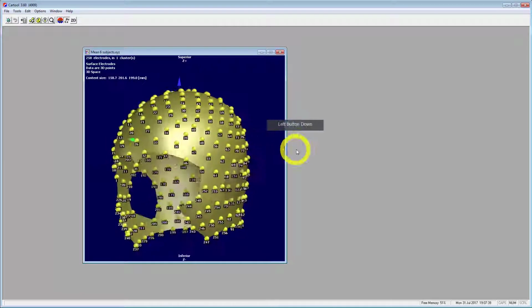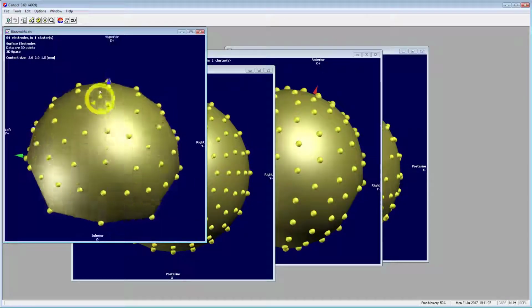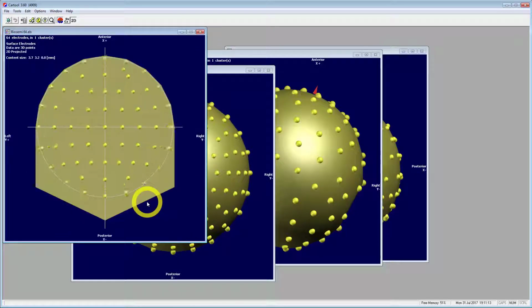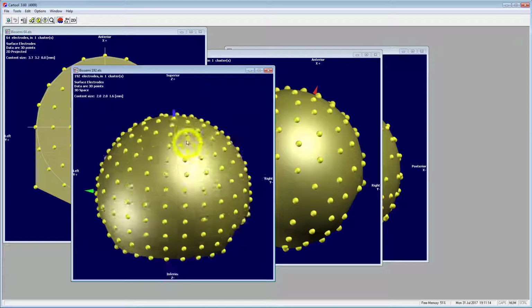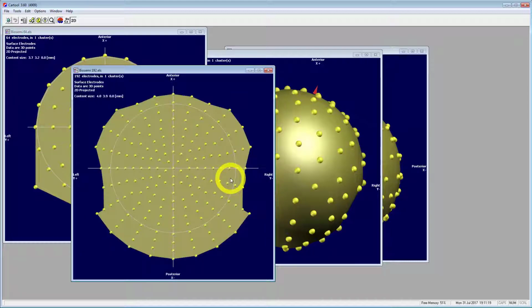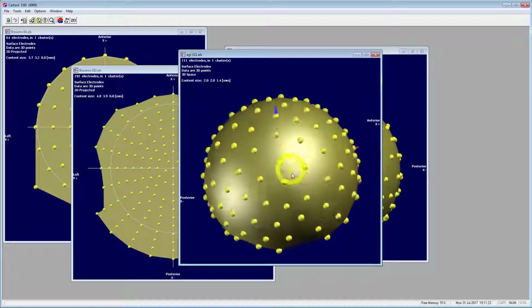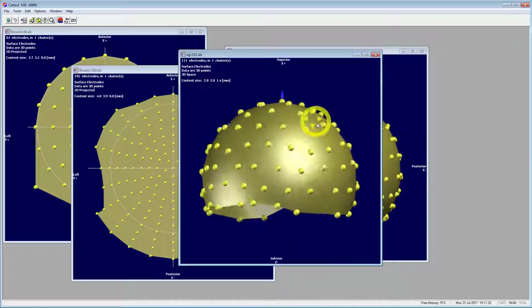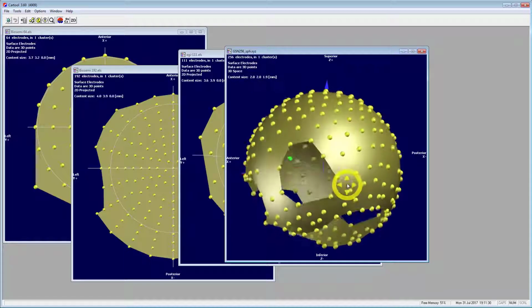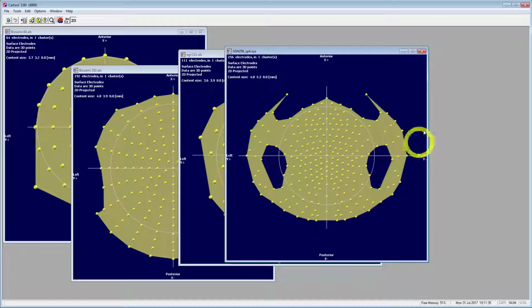While on the template topic, EEG manufacturers can sometimes provide their own template file. Be somewhat careful, as they can be rather topological than realistic. For example, it can be spherical, which is a sure sign that the coordinates are not realistic, which means the distances across electrodes are not correct. This will introduce some uncertainty if you use this template to create some inverse solution matrices.